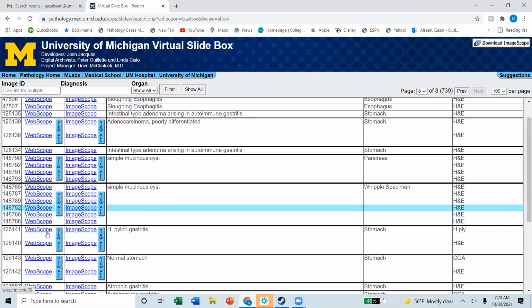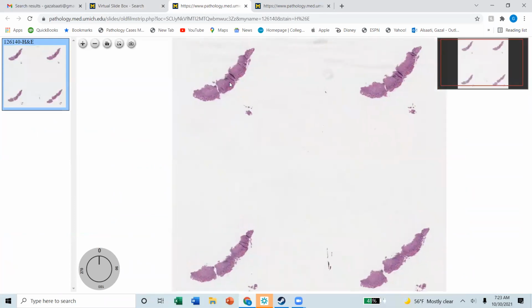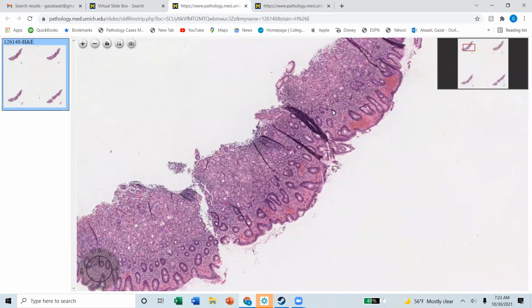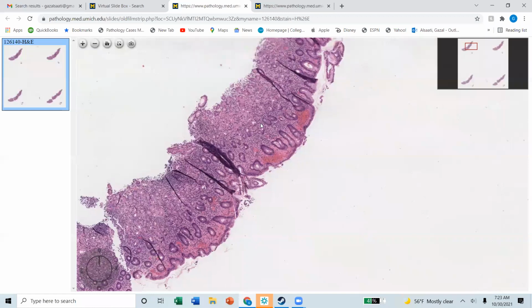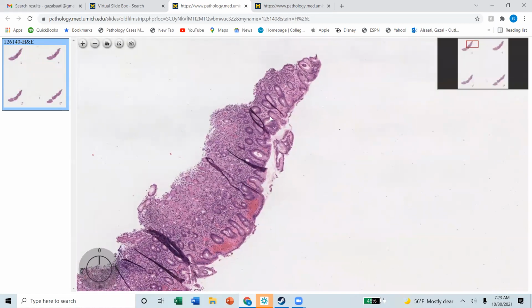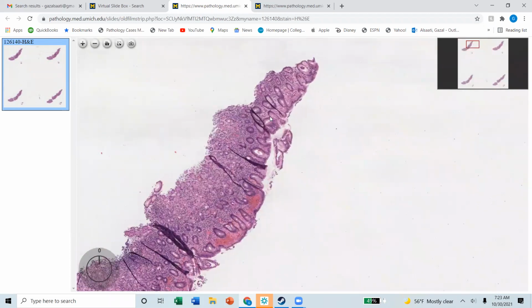Okay. H. pylori gastritis. I think this is an easy one to look at, but very, very important because you basically will have 4 or 5 a day. Your low power diagnosis will say that I have a band of lymphocytes. You see how my band is more superficial towards the surface? You will have, of course, deep pockets of lymphocytes, but just by looking at this, if my H. pylori is negative, I doubt myself again and again, and I squeeze the H. pylori out of my immunostain because you will find it.